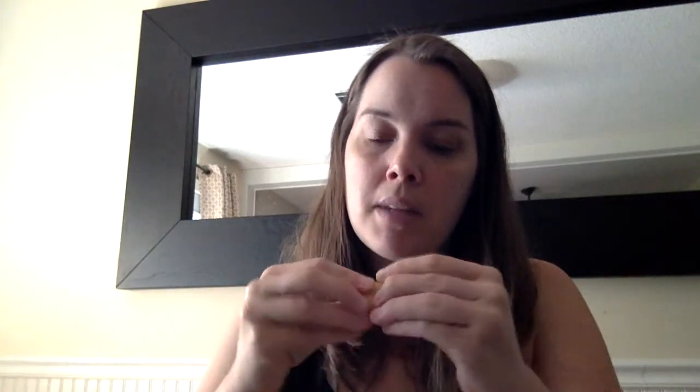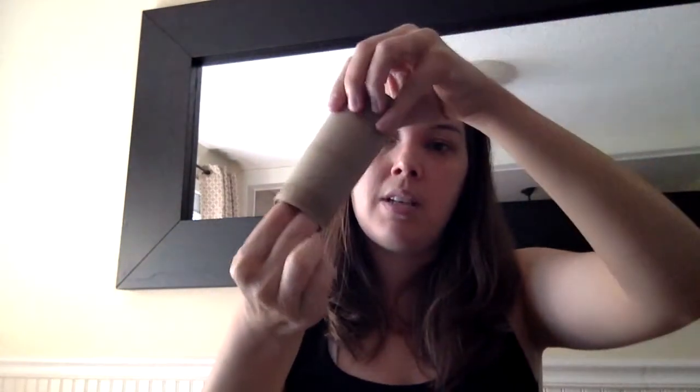So it's pretty easy though. One of the things that you can do is tie a string or something around it so that you actually have a pull cord if you want to do it that way. Or you would just think of it more like an OB tampon that doesn't have the actual string to it. You would make it really small. I'll show you one more time. You would insert it in, you would let it go, and then it would start from there to absorb your menstrual flow.